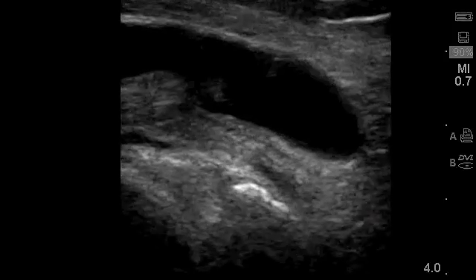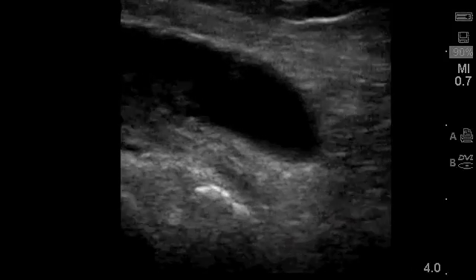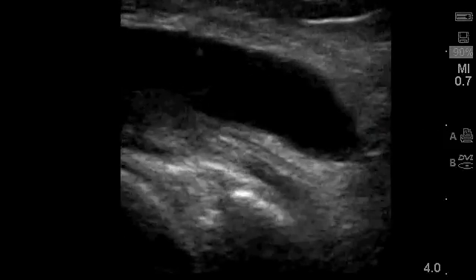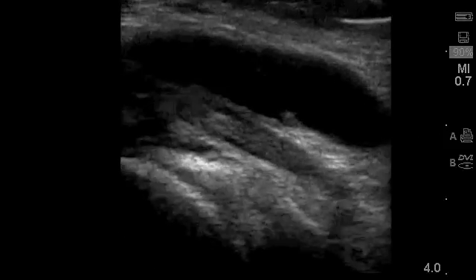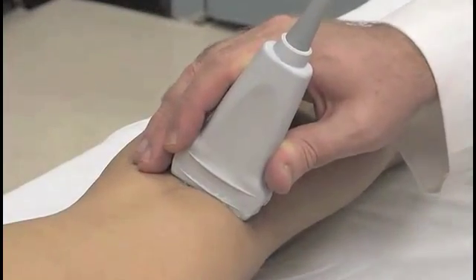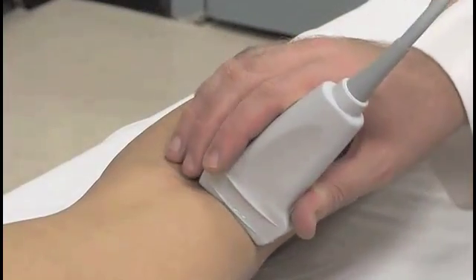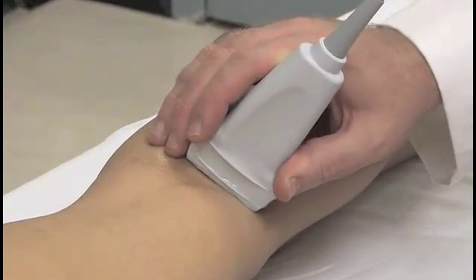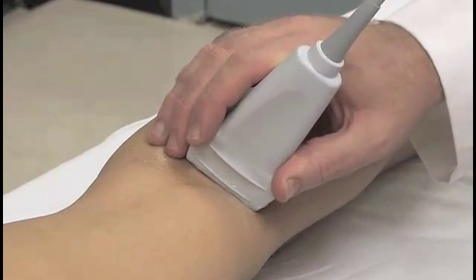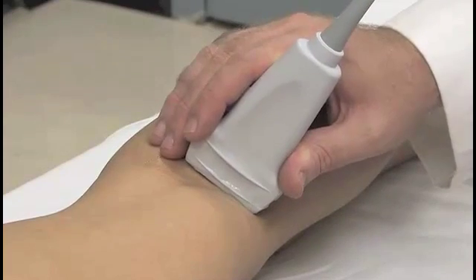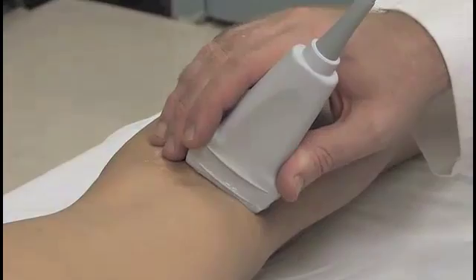Slide the probe caudally to visualize the inferior margin of the cyst, which should be distinct and smooth. Although ultrasound-guided aspiration of a Baker's cyst is not definitive treatment for the condition, it may be useful to temporarily alleviate symptoms and is a commonly performed procedure.